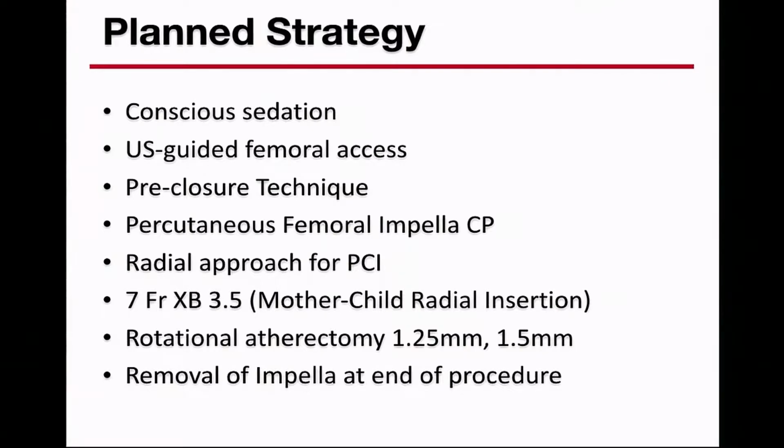Using a 7 French XB35 with a mother and child radial insertion, the way Stéphane likes to do it. I actually learned it from him. And move forward with rotational atherectomy using 1.25 and 1.5 burrs. And at the end of the procedure, we were planning to remove the Impella, not to leave him on it.